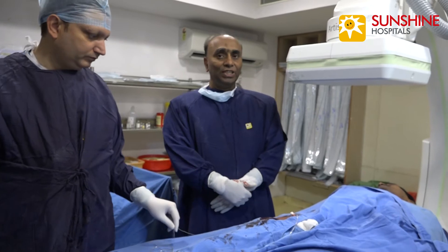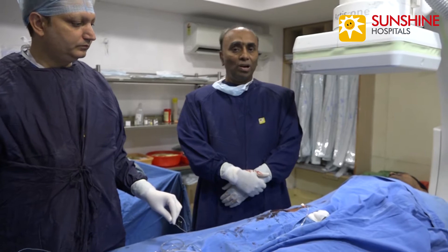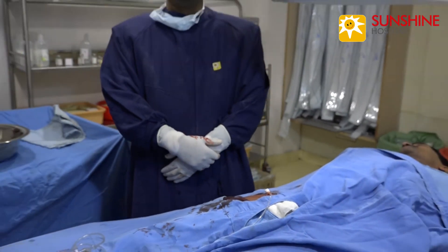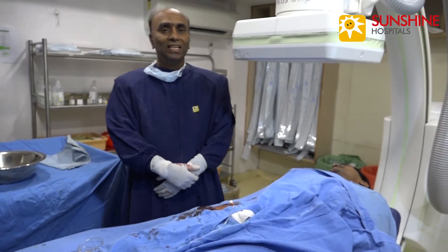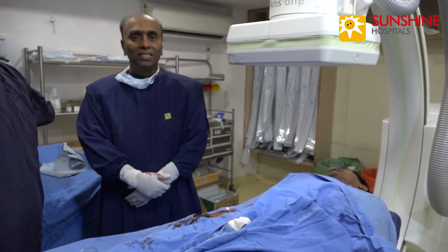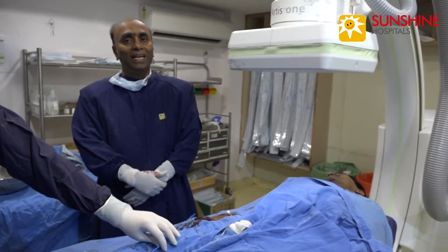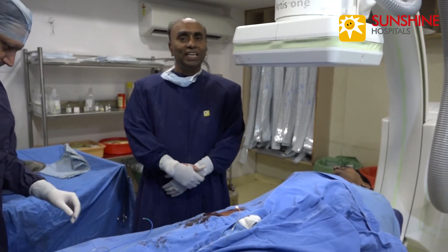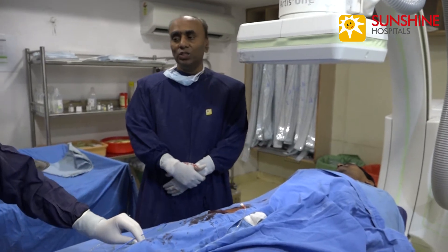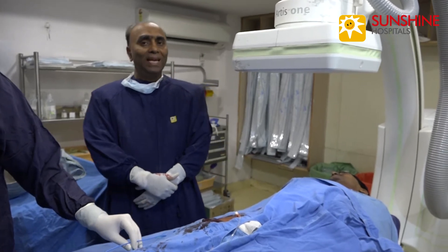We took a 7 French arterial sheath in the right femoral artery. Mr. Raja Reddy is having two vessel disease. He has got distal circumflex which is totally occluded, and distal left main and ostium showing intermediate lesions. In some views it is a significant lesion, and in other views it is showing a borderline lesion. So the entire decision depends upon the significance of the left main disease.